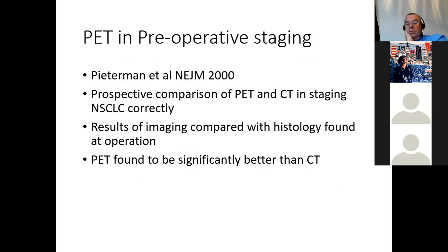So we can use PET in preoperative staging. Somebody's come up with an answer. We'll see if they're right in a minute when we stop.